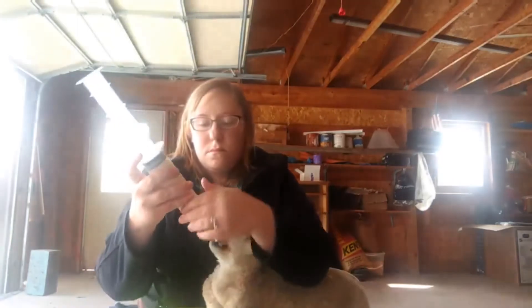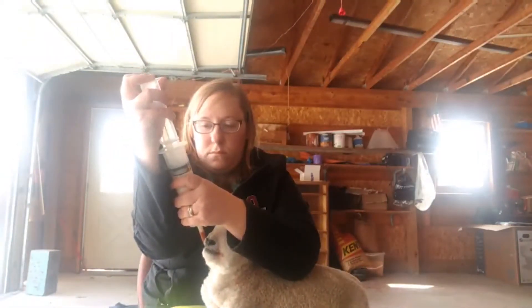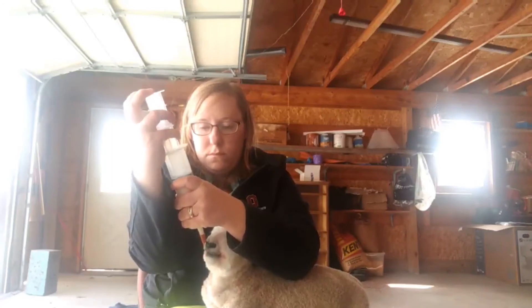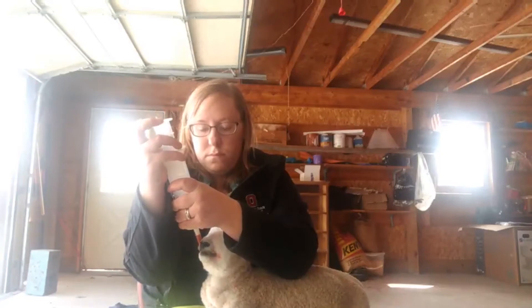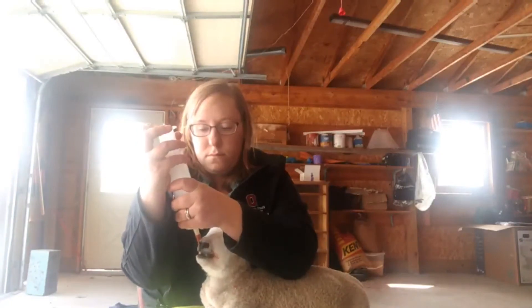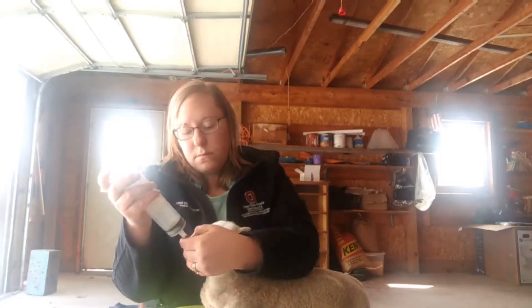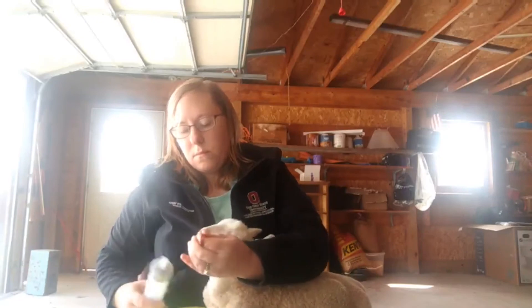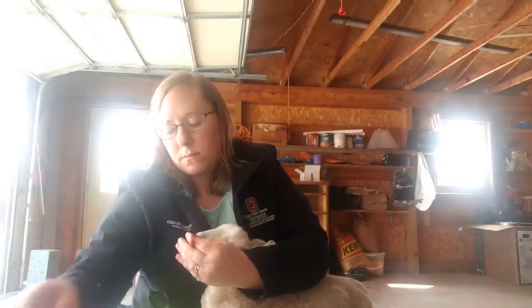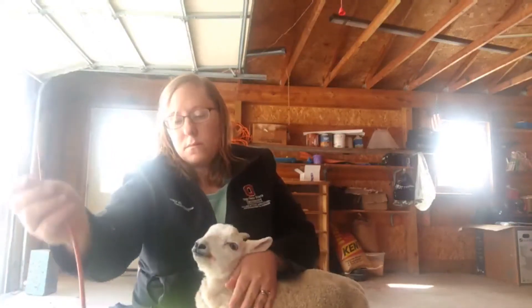At this point, it is ideal to clamp the tube, remove the catheter syringe, remove the plunger, and reattach the catheter syringe to the tube again. Then allow the milk to flow freely by gravity into the animal's stomach. If you depress the plunger too quickly, you could cause the stomach to rupture, especially if you have air trapped in the tube. So proceed with caution and allow slow flow into the animal's stomach. Then clamp the end of the tube and remove it from the animal's stomach.